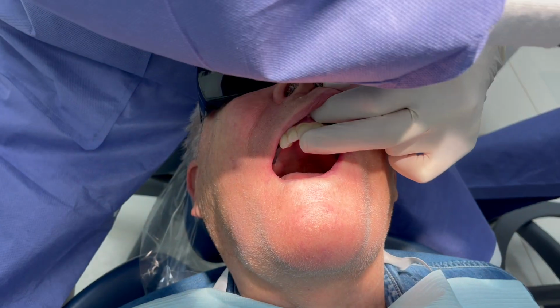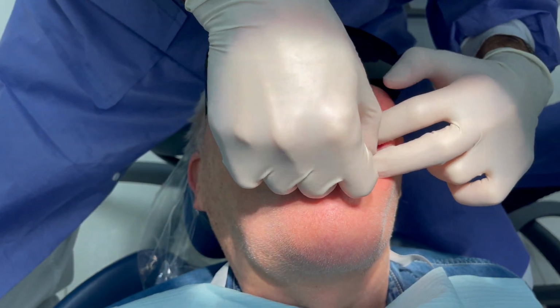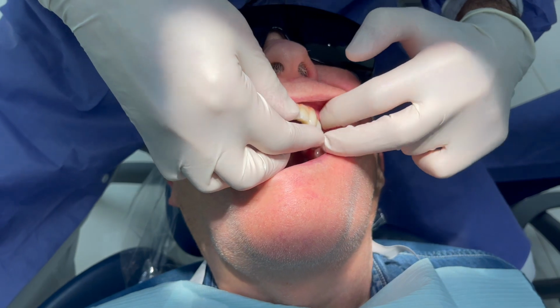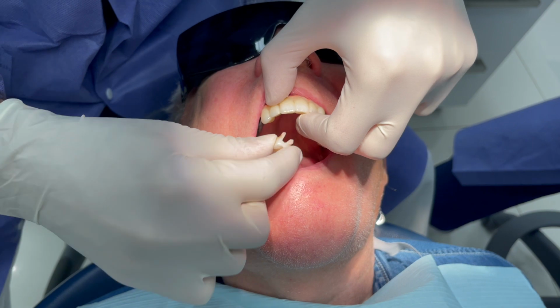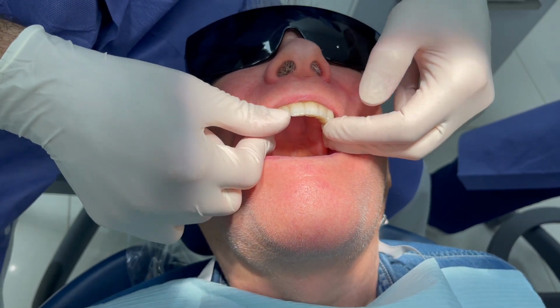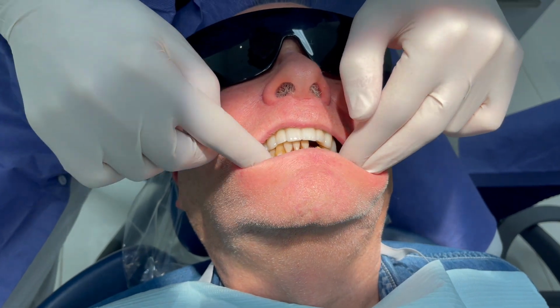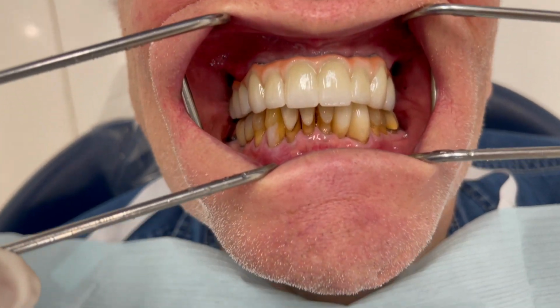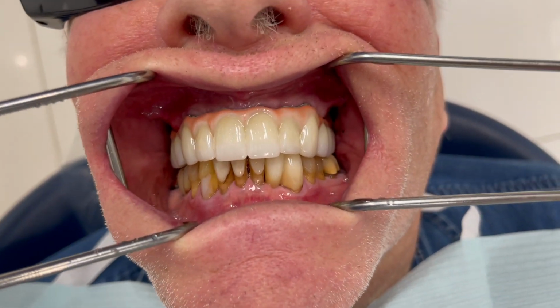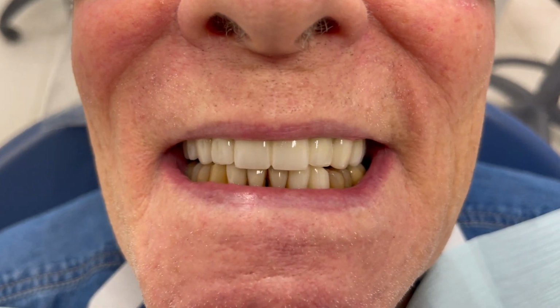We deliver the final, and usually these can either be cemented or screwed on. Either way, the patient will have a final prosthesis that went through a lot of steps of verification, so he or she will not be surprised about how the final outcome is going to look, and that will take a lot of the stress and the "I don't know" factor out of the window. At the end, we get a great result, a result that the patient is happy with, that they feel confident about, and they go on with their life.